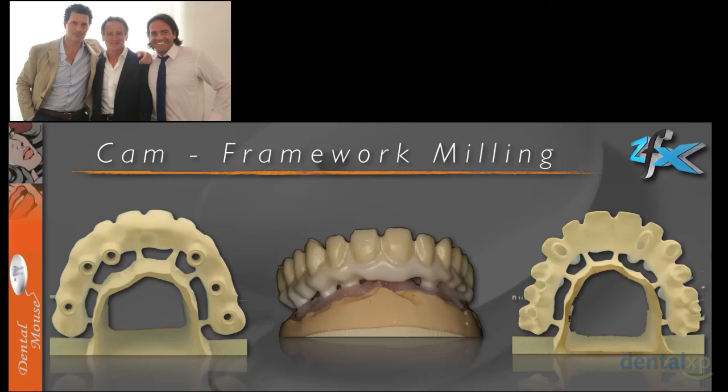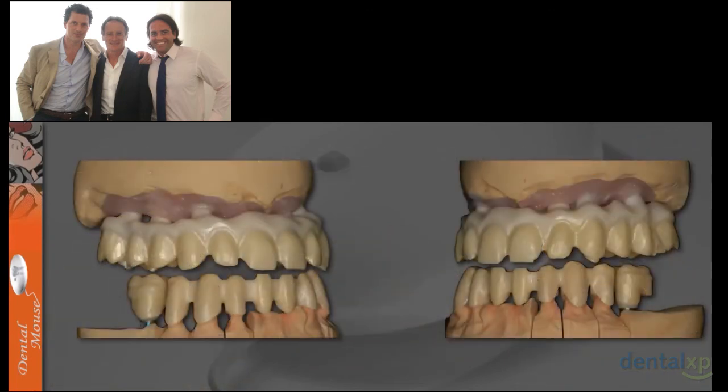We are going to start painting this zirconia in order to have aesthetic success. You can color it, there are different colors available, and of course it is the background experience of the technician that will choose the correct colors for dentin and the correct colors for enamel, to make a pleasant work from an aesthetic point of view. You see here again the framework tried on the model.